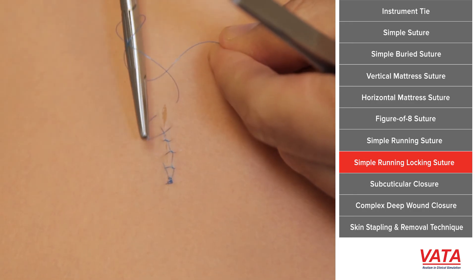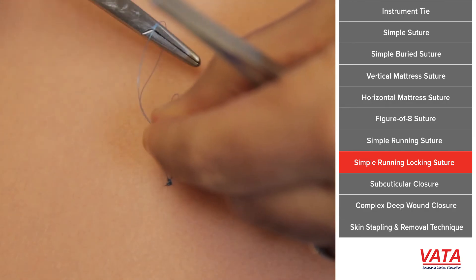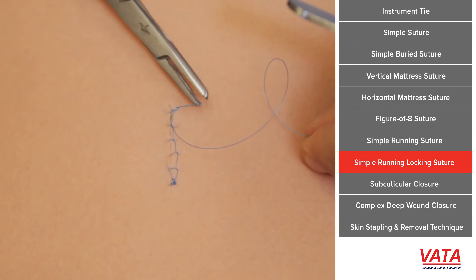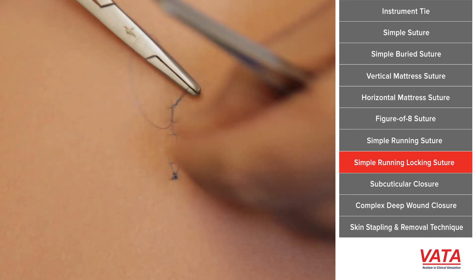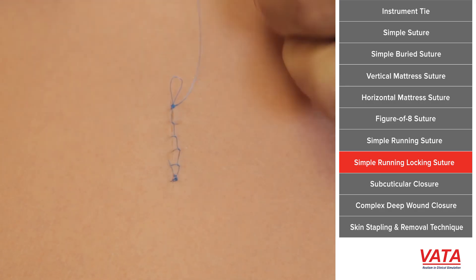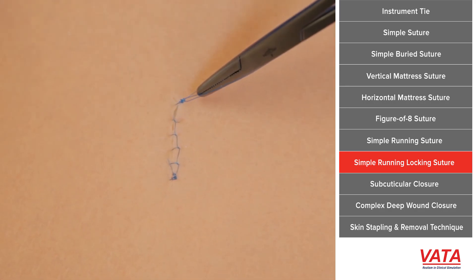I always end these types of running sutures by grabbing the loop and then doing your instrument tie — two times around will lock it. If you're having problems with it locking, you can even wrap it three times around the needle driver, and that really holds it in place. Only one time around for each subsequent throw.